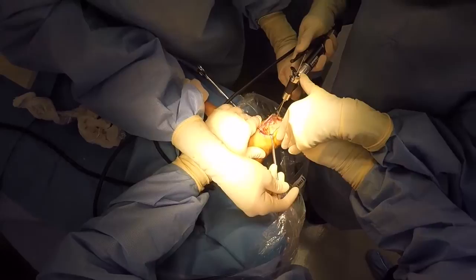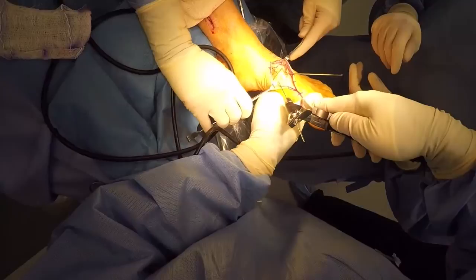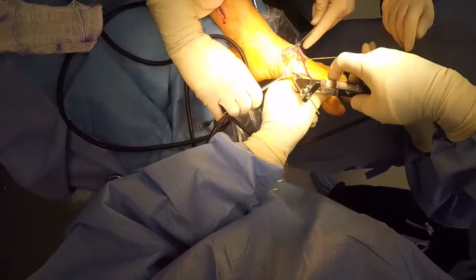So here we are with pinning of the bony surfaces with the foot held in an appropriate position. With one pin, you have very poor rotational stability, so we're actually putting a second pin, plantar medial, as provisional fixation for our fusion site.